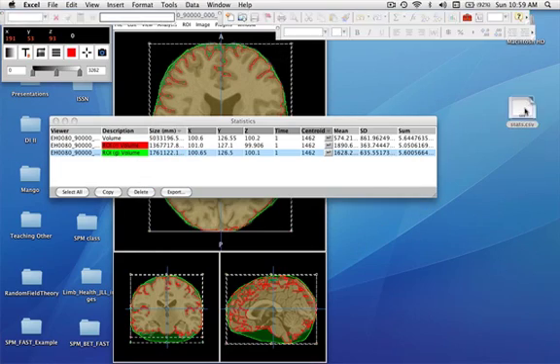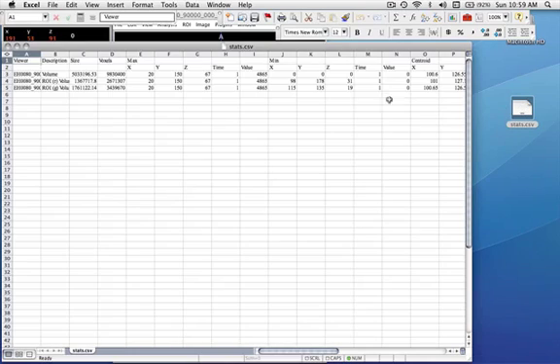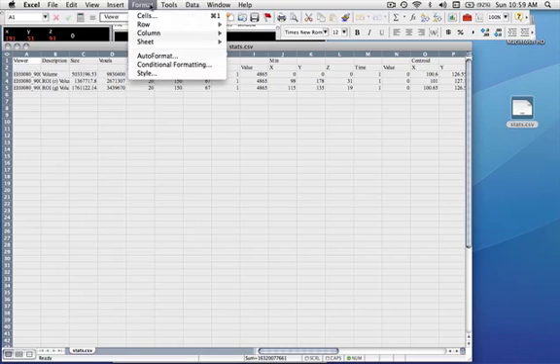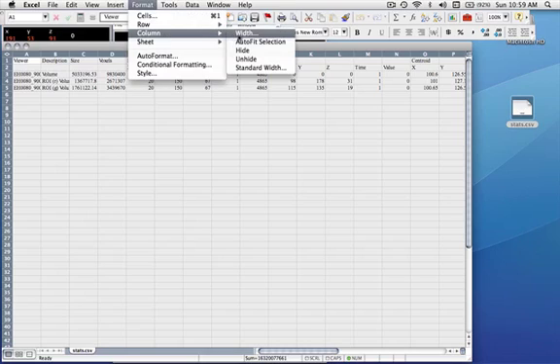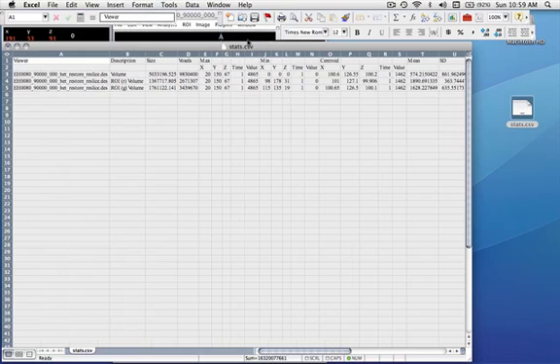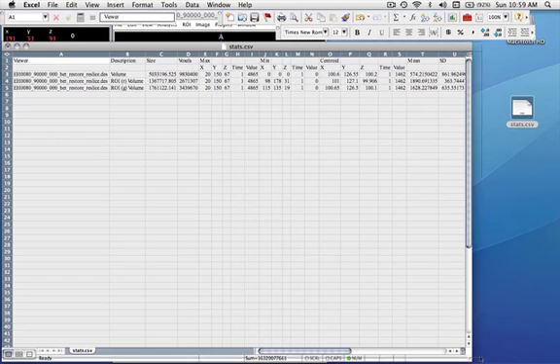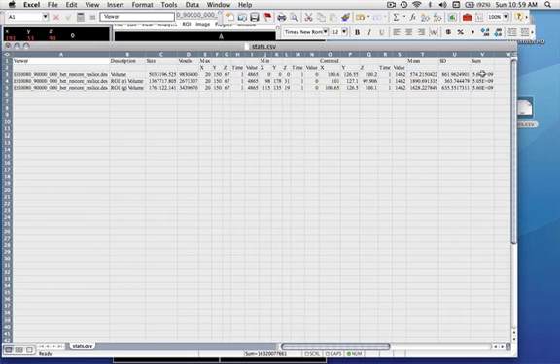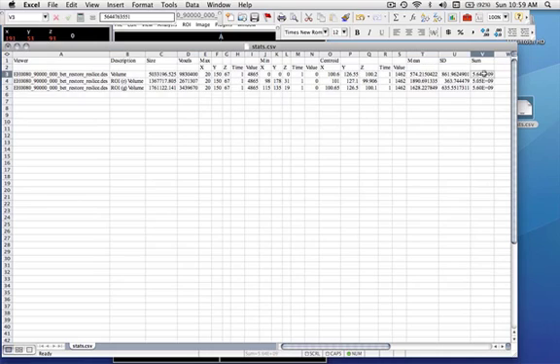It's a stats file. If you click it, it opens nicely in the spreadsheet. You can quickly reformat that so you can see all the data. You'll notice that the numeric precision is fairly high in Mango. We work in floating point internally. And if I click over here on these numbers, you can see how big the numbers really are.